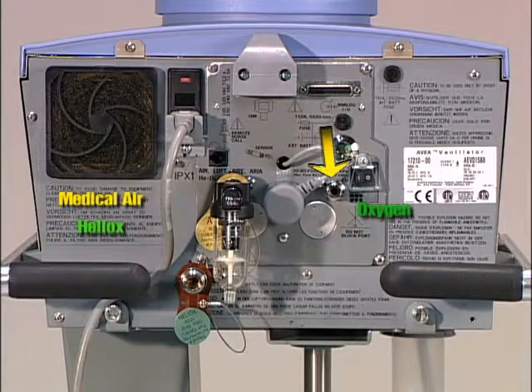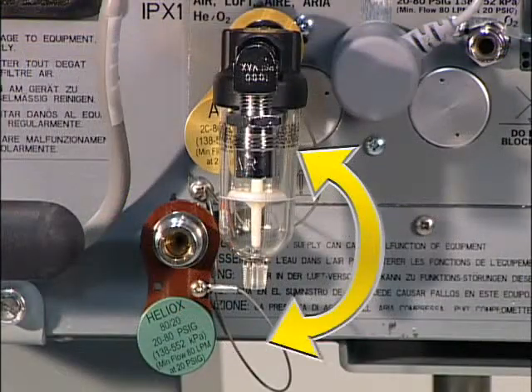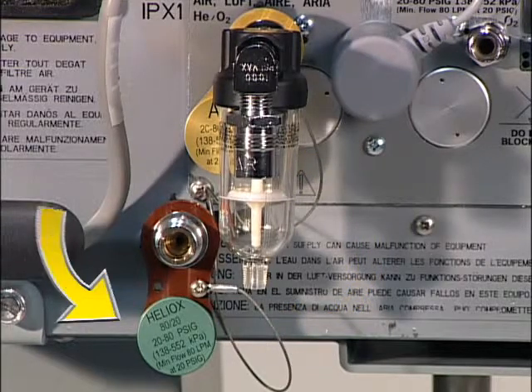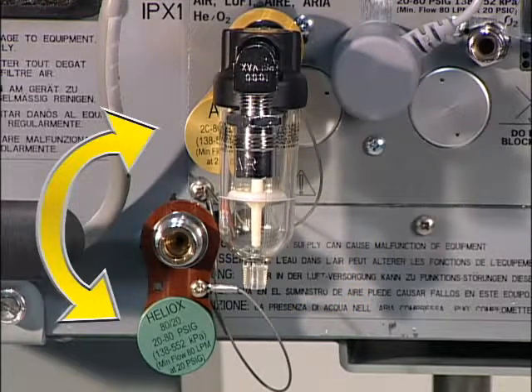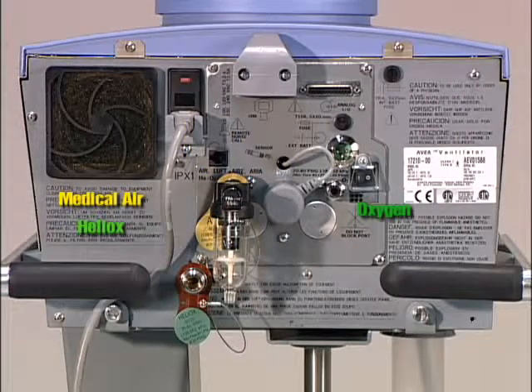High-pressure gas connections are specifically keyed for oxygen, medical air, as well as heliox. To switch between medical air and heliox input, simply screw on the appropriate smart connector. This unique system signals to AVEA which type of fitting is attached and, therefore, which gas controls to initiate. Standard fittings are used for oxygen, air, and heliox.